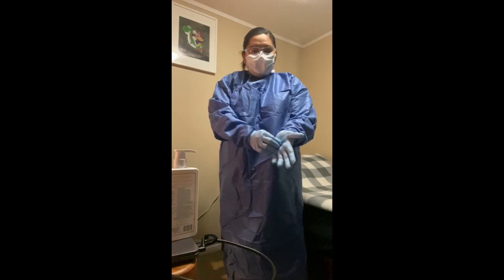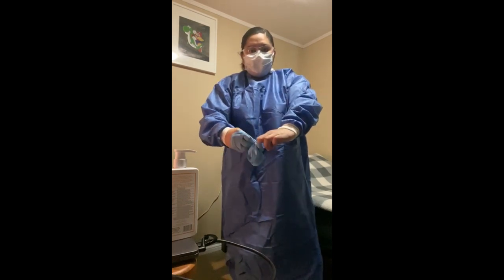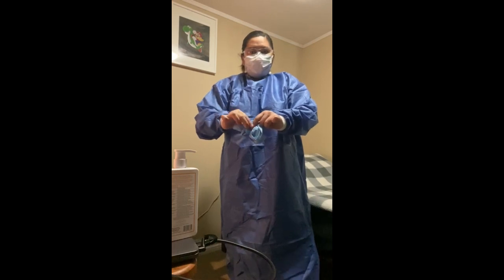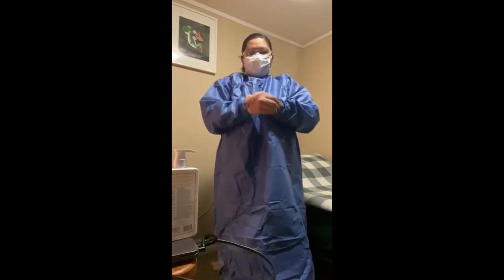First, remove the gloves. Grasp the outside edge of the glove near the wrist and peel away from the hand, turning the glove inside out. Slide an ungloved finger or thumb under the wrist of the remaining glove. Peel the glove off and over the first glove, making a bag for both gloves. After this, perform hand hygiene.